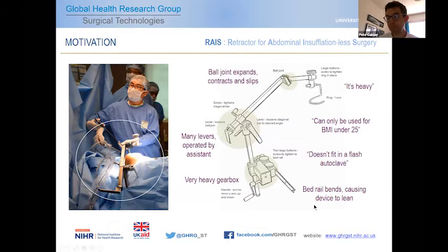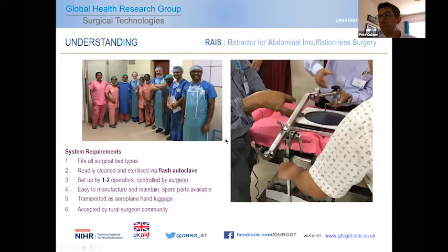So we went through this procedure, and what we do as an engineering team is we basically derive a series of requirements for the system that we're going to design. And that's only possible if we can work really closely with the people who are actually experts in this. So Dr. Ganaraj, Dr. Lovinish, Dr. Anurag, all these people have provided their expertise, and we've seen and learned from what they've done. And that allows us to have a look at this and decide, well, here's a series of requirements that we need to design into our system.